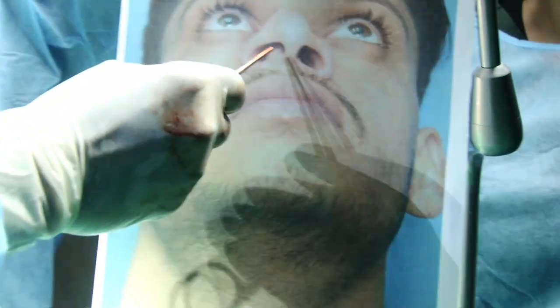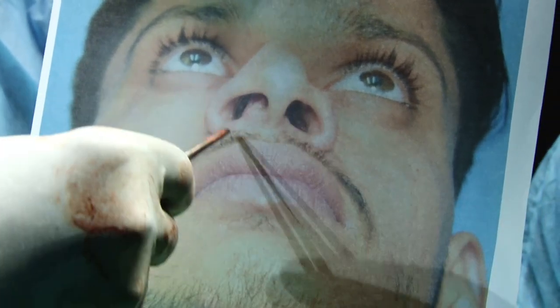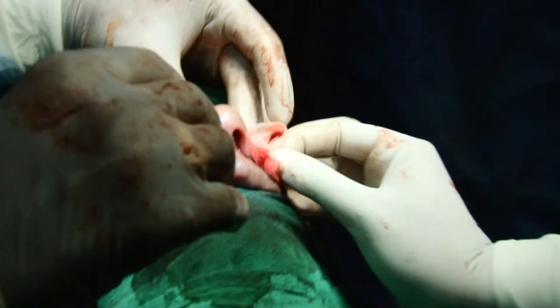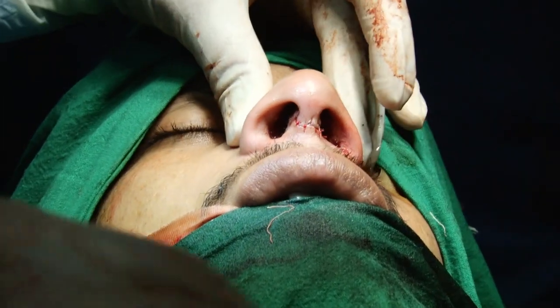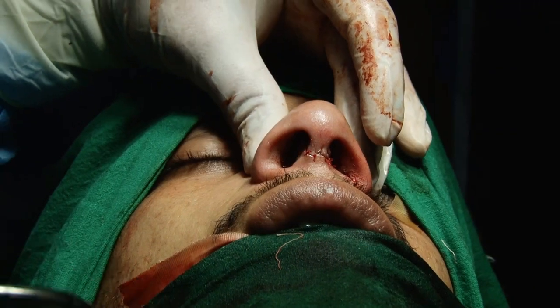So earlier, the patient had this deviated part of the septum that we corrected. That is the main culprit for the functional component. So we corrected this one. And now look, we have both sides of the nostril equal. It's very nice, really improved. Thank you.